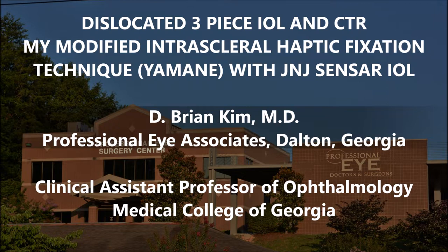This patient still had a dislocated lens, and now I have the challenge of taking out not only the lens but also the capsular tension ring. You'll be able to see my modified intrasceral haptic fixation technique using the Johnson & Johnson Sensar IOL.